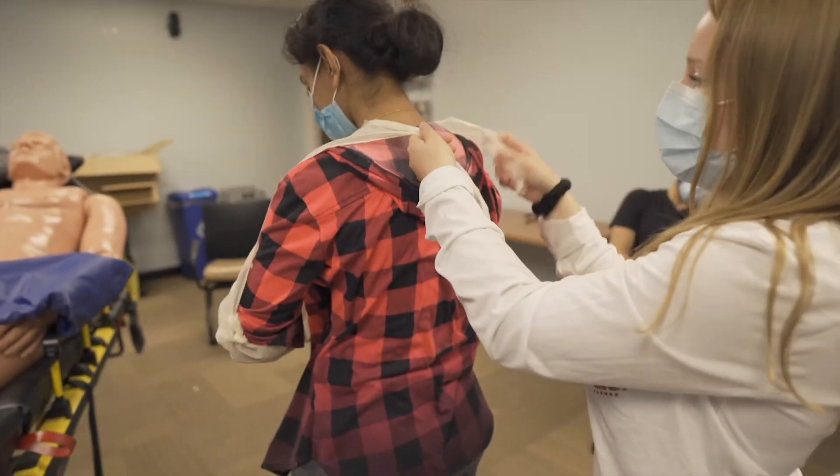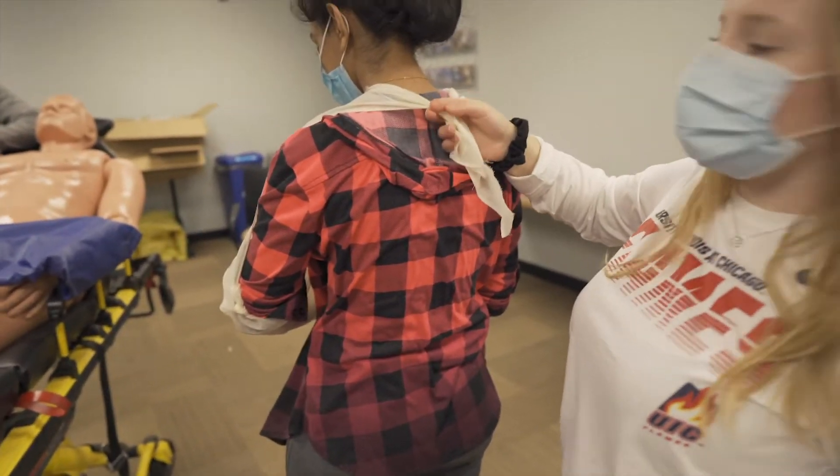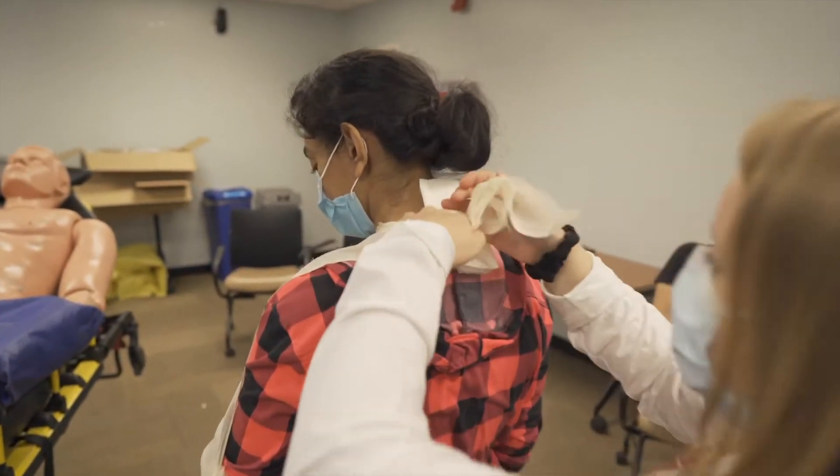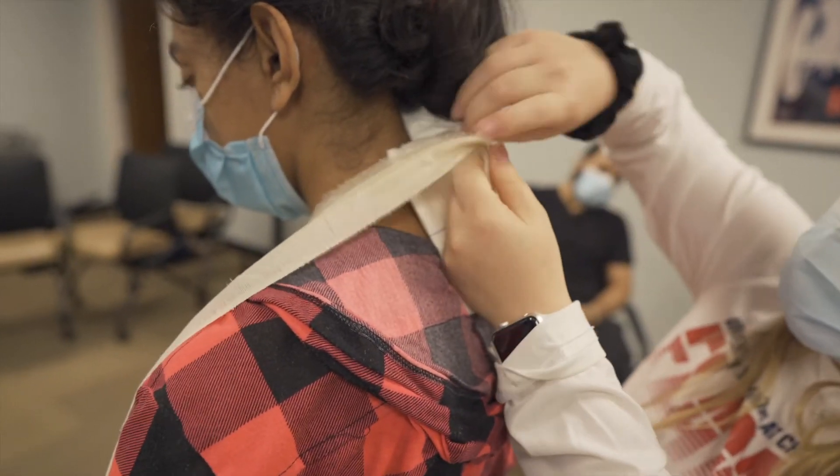Kimberly's going to go behind the patient and tie a knot. Then she's going to take a piece of gauze and apply it between the patient's neck and the knot to prevent any type of chafing.